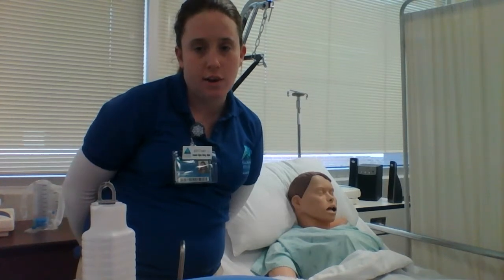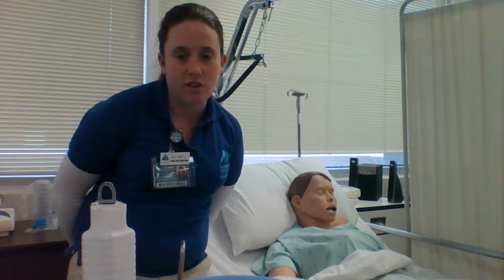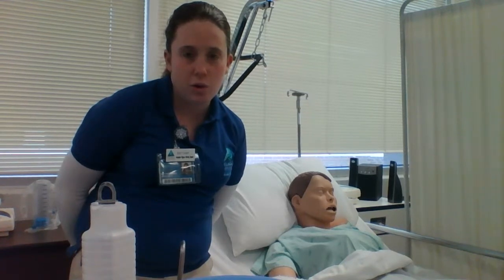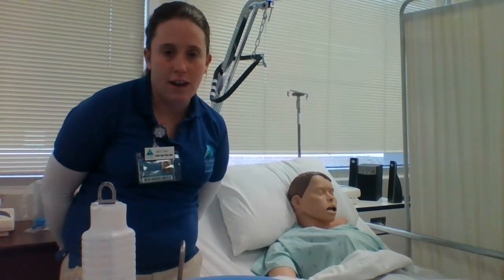Today I'm going to be inserting an NG tube. The first thing that I'm going to do is verify the physician's orders, and I see that he wants an NG tube inserted for suctioning, so I'd use suctioning tubes. And I'll go ahead and gather my materials and enter the room.